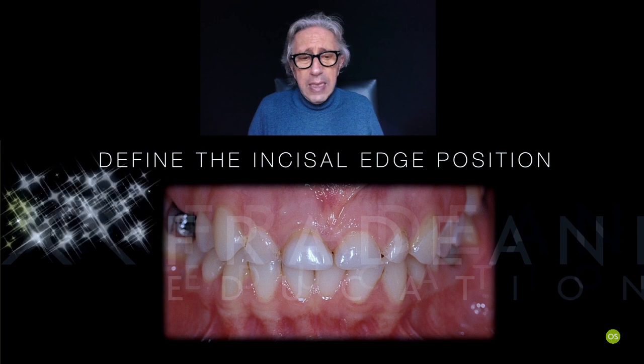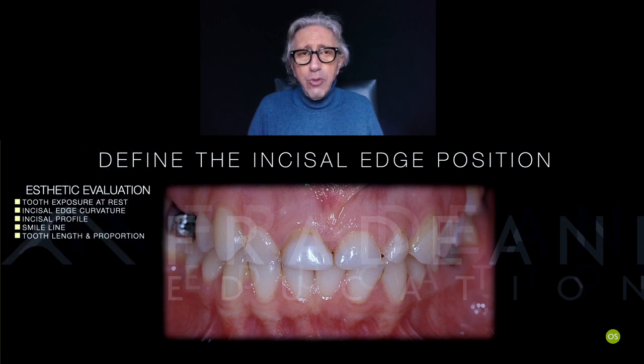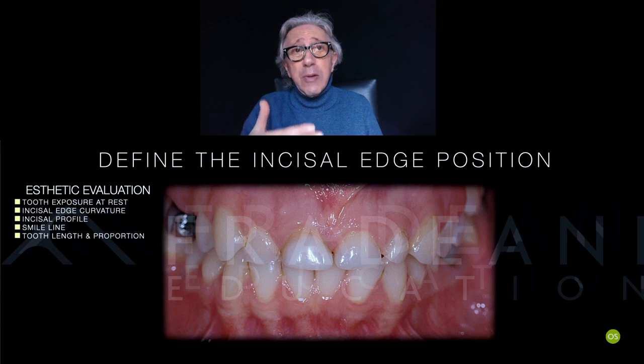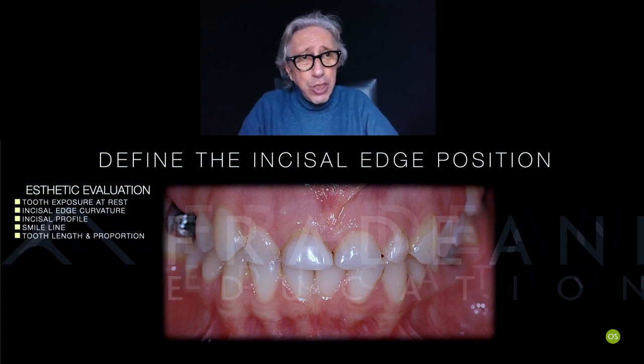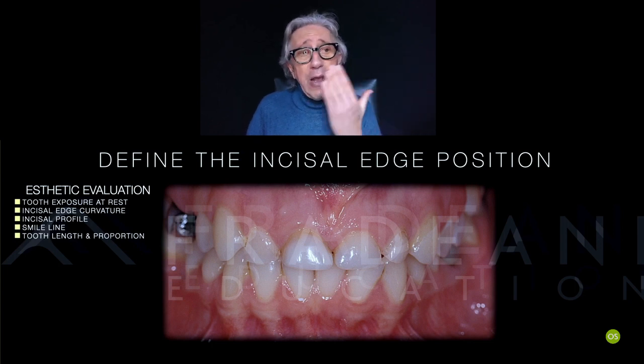And to define the incisal position, we have to evaluate all the aesthetic and functional parameters. Aesthetically, first of all, tooth exposed at rest, as I said, was 0.5. We have to add to it, and we have increased it with the mock-up, the direct mock-up. And then incisal edge curvature. Thanks to this elongation of the two central incisors, we elongate all the incisal edge, which becomes convex. Look at the incisor profile from the lateral view. And then look at the smile line.